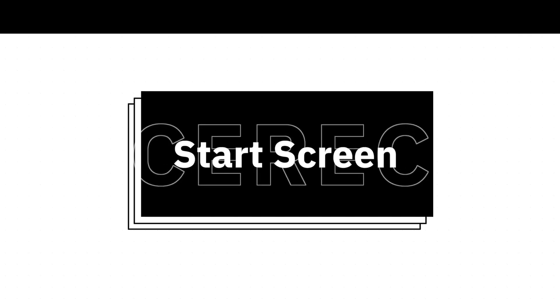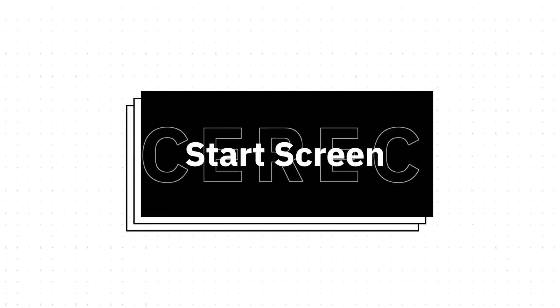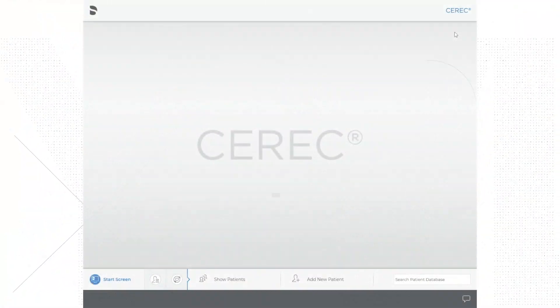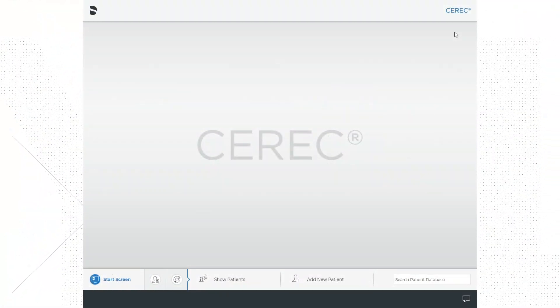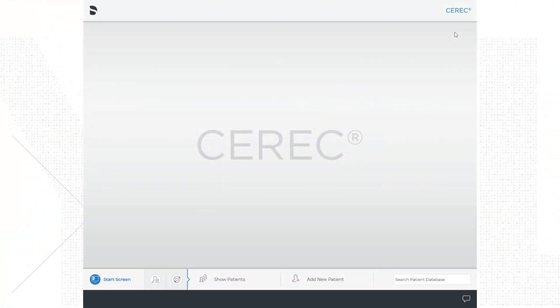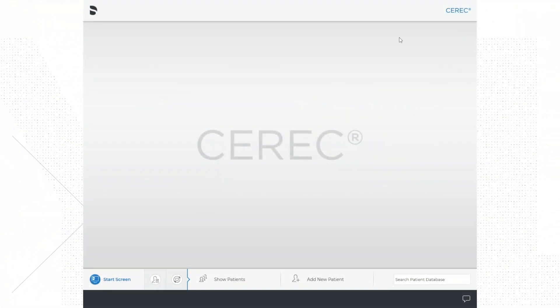So after you open up the software, you will see the start screen. At the top left of the screen, you will see the Dentsply Sirona symbol, which looks like the letter D with an S inside of it.